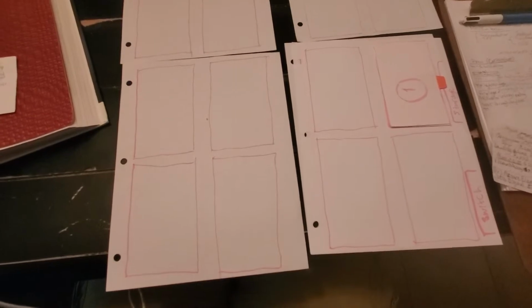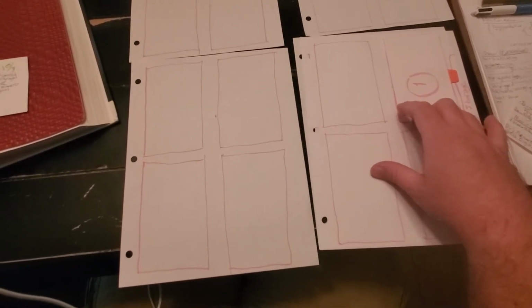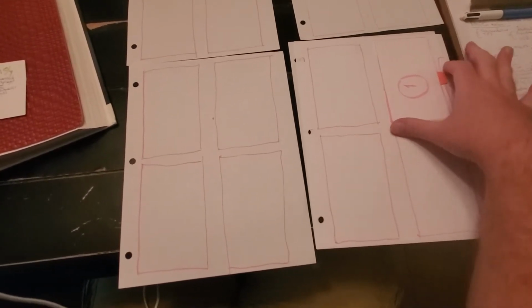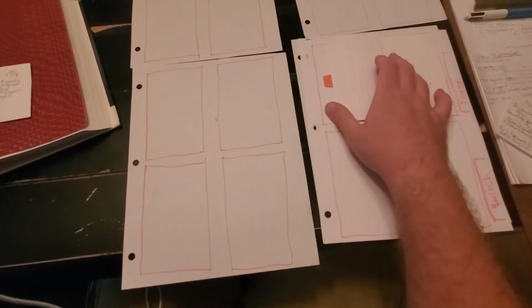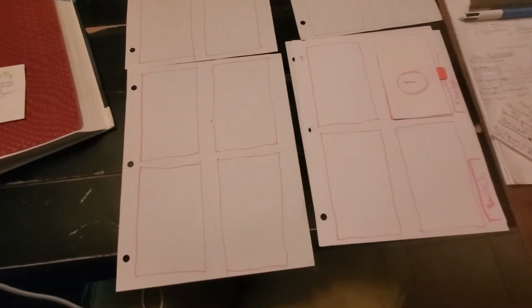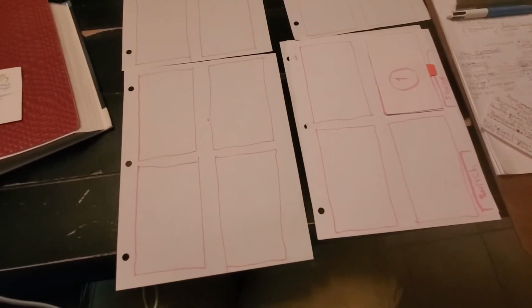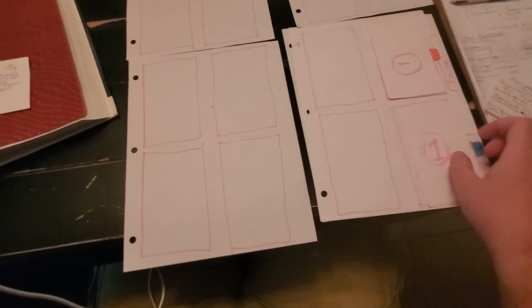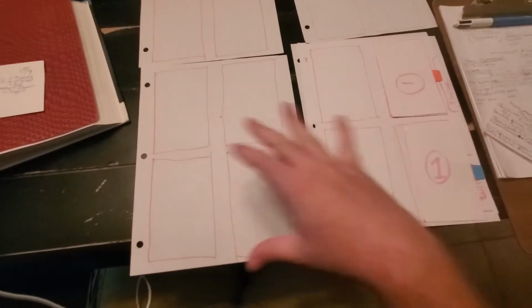Okay, so you got your picture element. Photon comes down, hits it. It says, yes, I'm on. It changes that electron to basically a 1. And you get a bunch of 1s. So we'll place this over here. So basically you get a bunch of 1s and 0s.